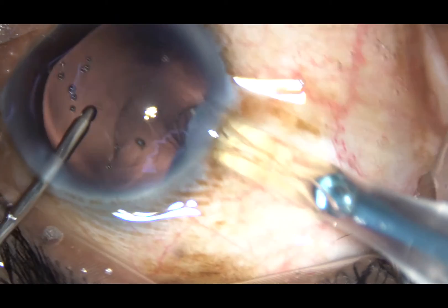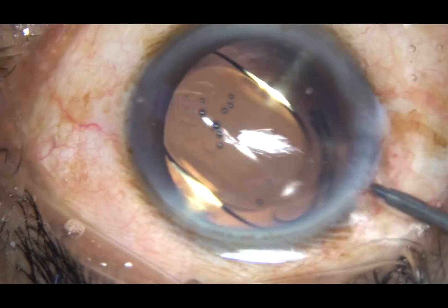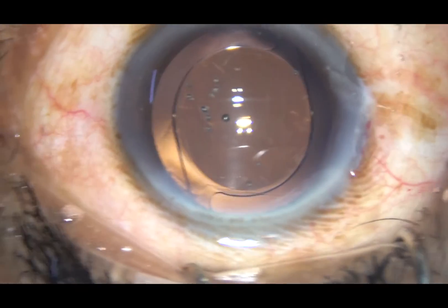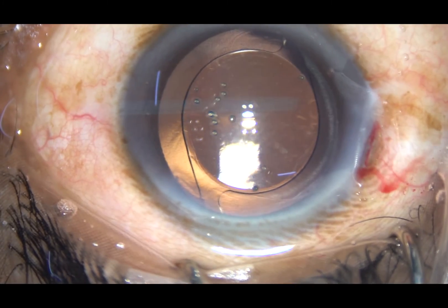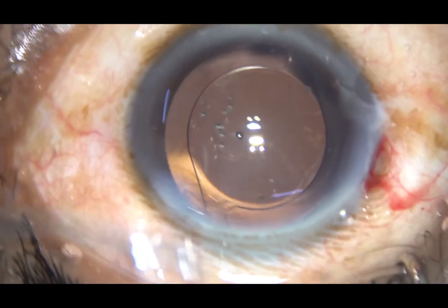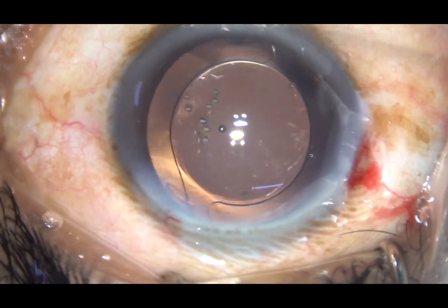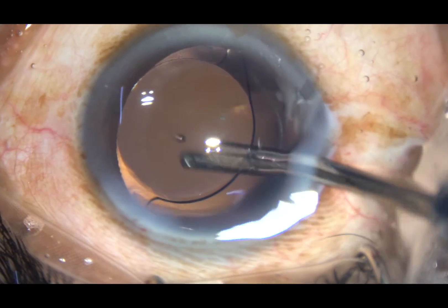Now a hydrophobic acrylic intraocular lens is implanted in the capsular bag. Whatever viscoelastic substance was in the lumen of the cartridge is removed by irrigation. This is a bit of moxifloxacin. I hydrate the side port so that the stab wound becomes watertight. This is the final lavage of the anterior chamber — whatever viscoelastic substance sticks to the corneal endothelium is irrigated out at this time.